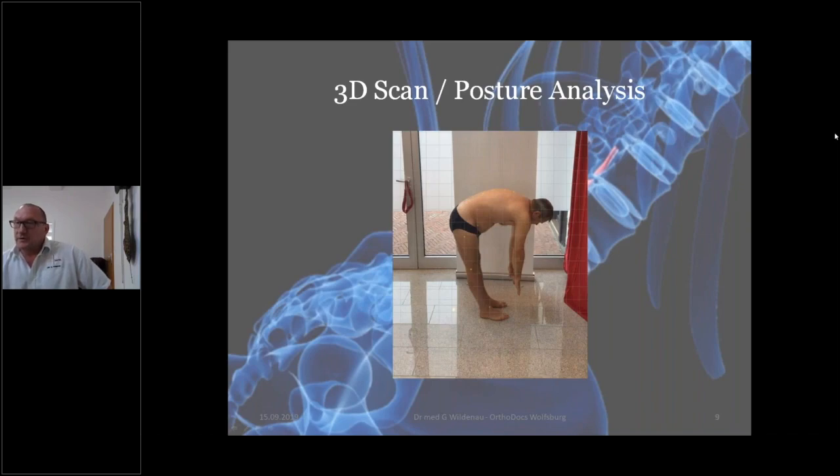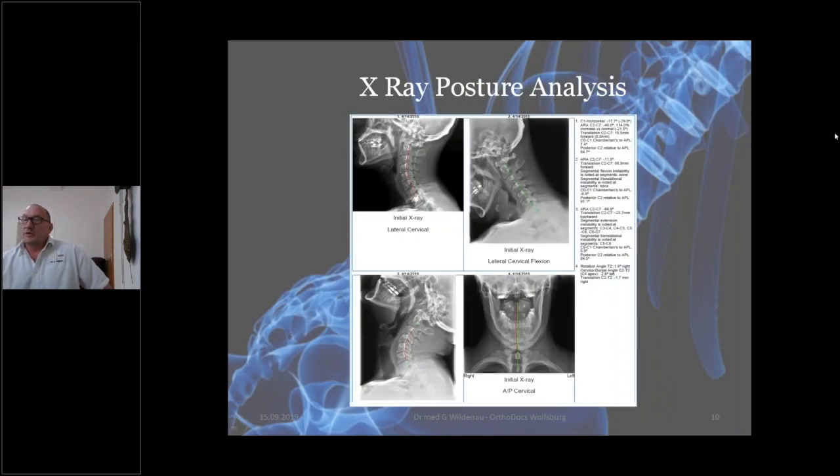Now, of course, we use the everyday or the traditional analysis as well. Of course, that's a natural given. Our X-ray analysis is not so much that we are hunting for degenerative changes, tumors or fractures. If we are looking for function, on the endoskeleton, we are looking at extension and flexion views of the cervical spine as well as the lumbar spine, and then we measure for pathologies.